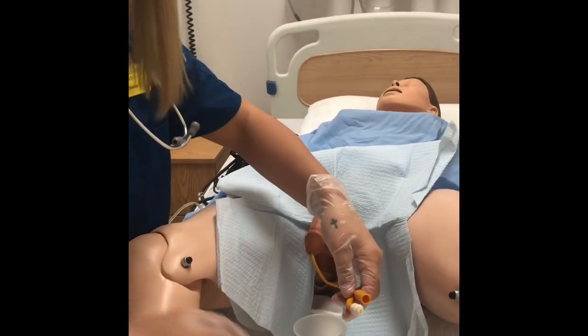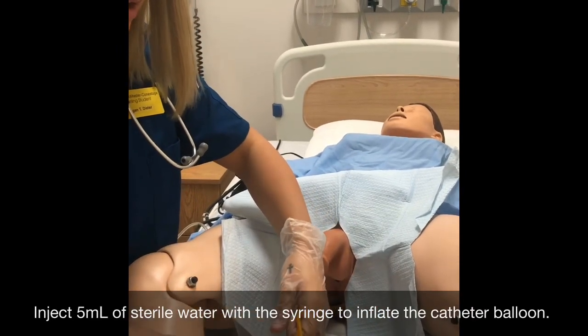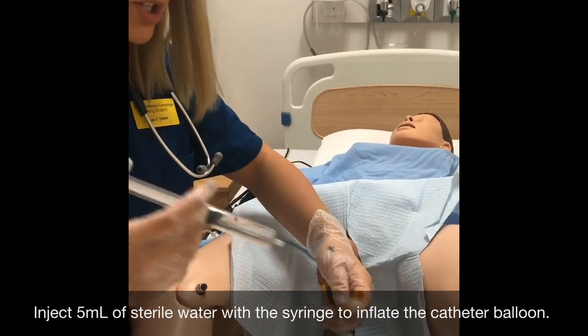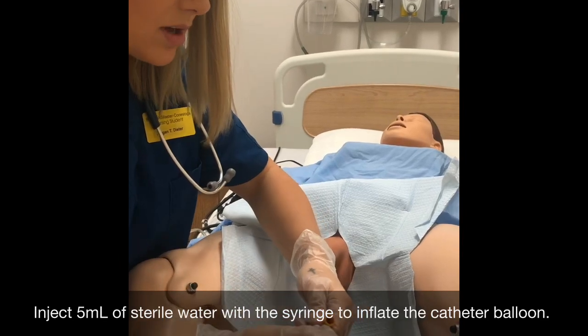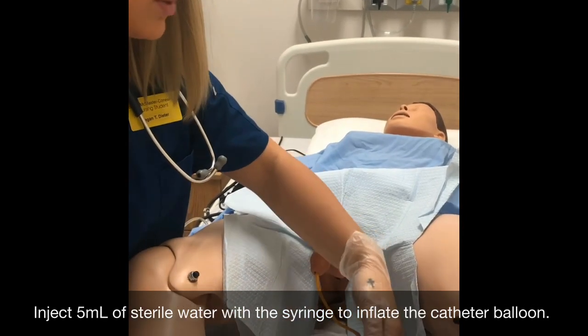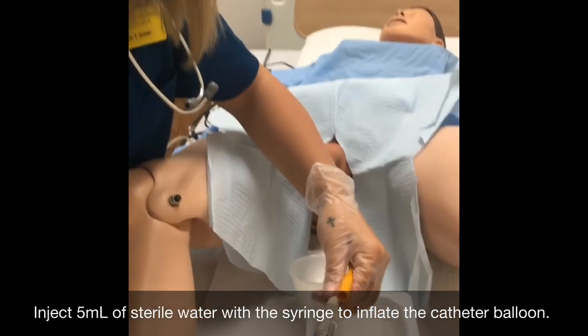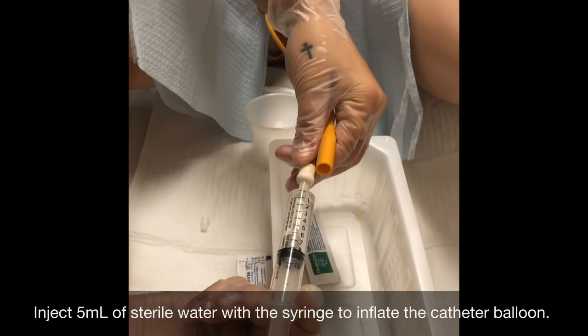And now I'm going to take my sterile water with my syringe, and I'm going to inject it into the catheter to inflate the balloon. I'm going to insert 5 milliliters into this balloon. Yeah, it's just sitting in there.